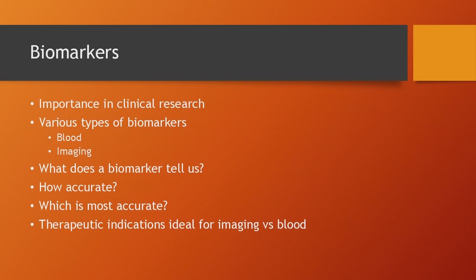And in this model, we try to minimize the degree of uncertainty in the measurement. And that means that we have to control the biases due to the use of different vendors in the image acquisition. That means that if we generate images using a machine from a vendor A or from vendor B or vendor C, we will get images with slightly different quality and different properties. So we have to cross-calibrate across vendors. And the processing and the algorithms can also introduce variability.